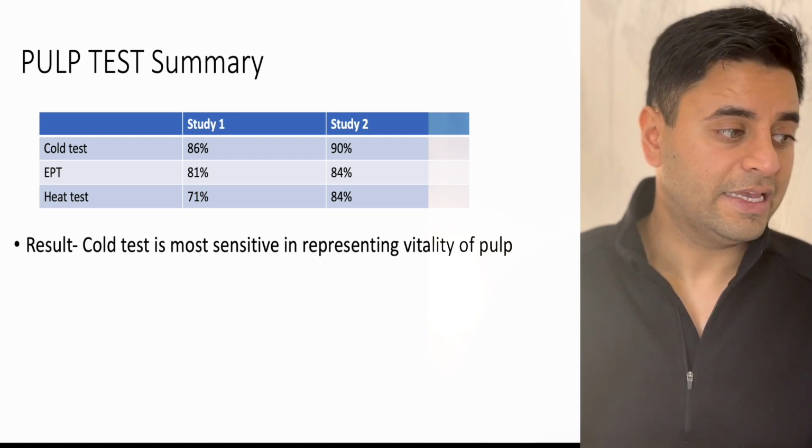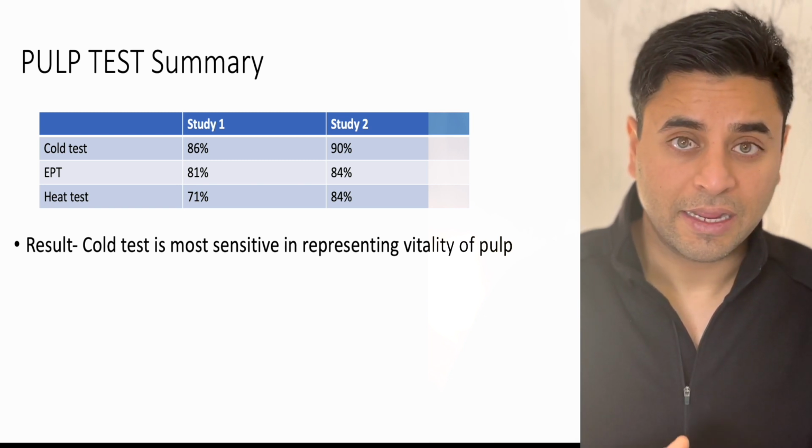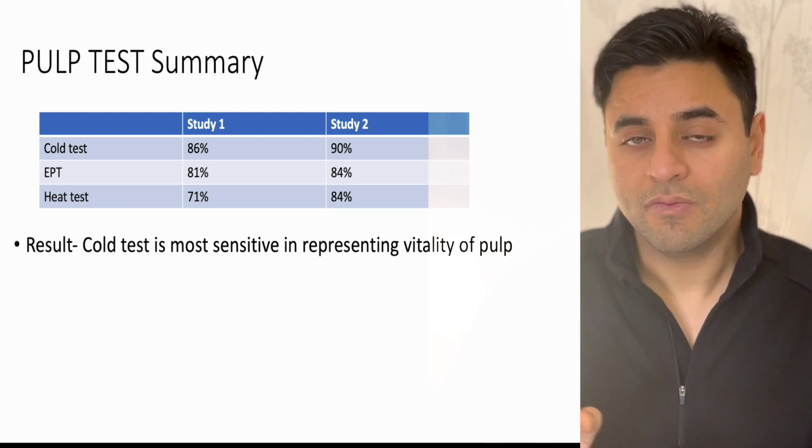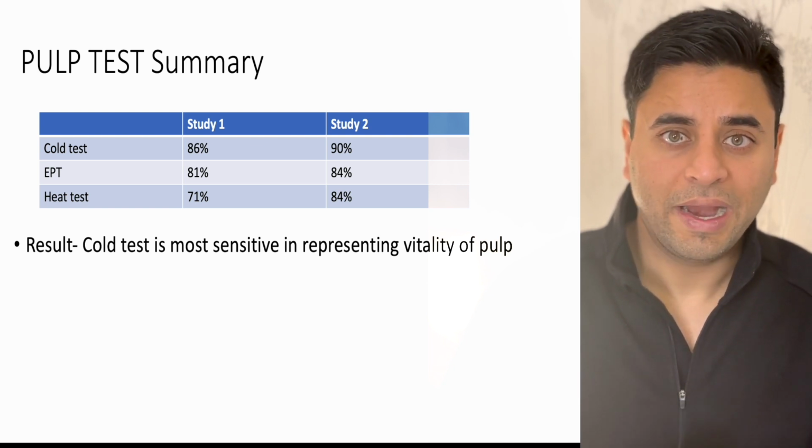Overall, what we can say is cold test is most sensitive in representing vitality of the pulp. Once again, cold test is most sensitive in representing vitality of the pulp.